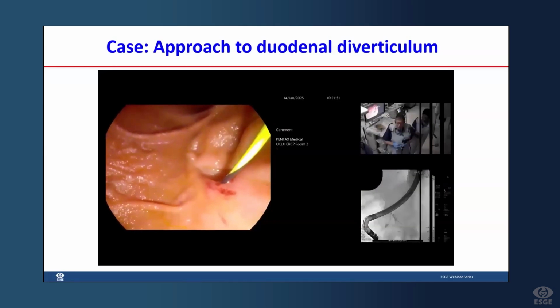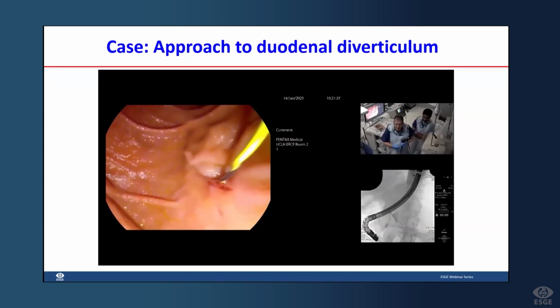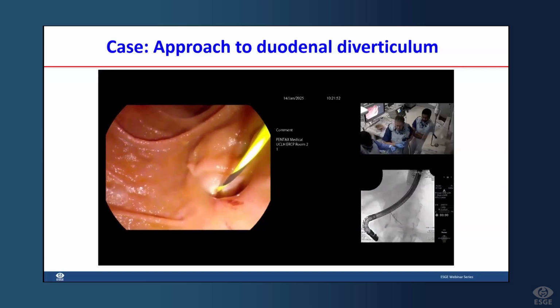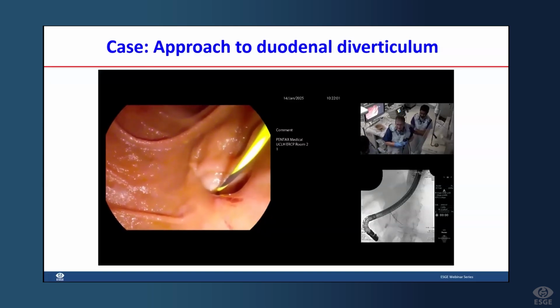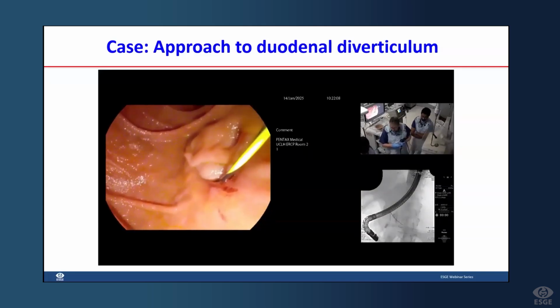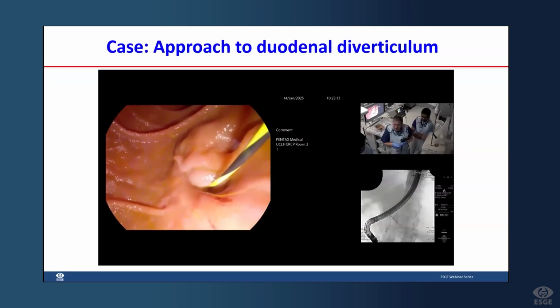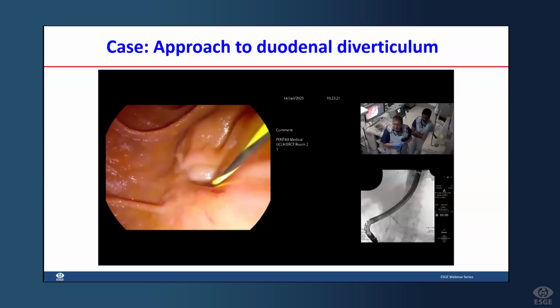Now, yeah. My wire is clearly intraductal, but there's a little bit of contrast there that I don't particularly like the look of, but can't do anything about it now. Now I could do double wire technique here, but I don't want to lose this position, and I definitely want to have a pancreatic stent in. And I think I may be able to demonstrate that using a pancreatic stent here can be really helpful. So you can see that the papilla has now disappeared again. And what I hope to show is that by putting in a pancreatic stent, I can bring the papilla out.